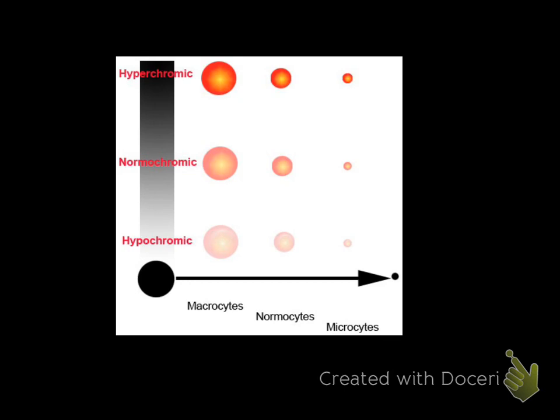So admittedly, a lot of the anemias we see are not very exciting, and they're what we call normocytic normochromic, kind of right in the middle. So not very exciting. Classic patterns we will see. So you're always going to see there's anemia, and then you're going to determine if it's regenerative or non-regenerative if you have the ability, either from polychromasia or reticulocytes in the appropriate species.